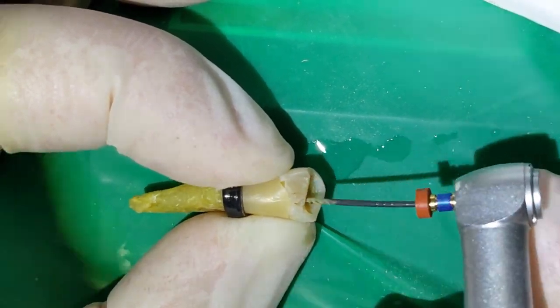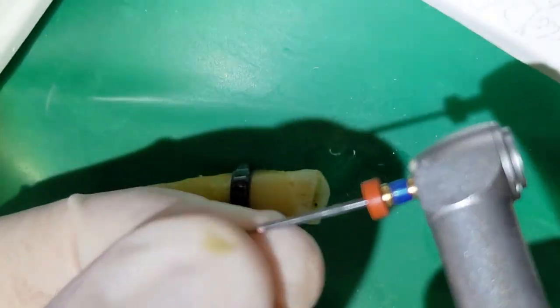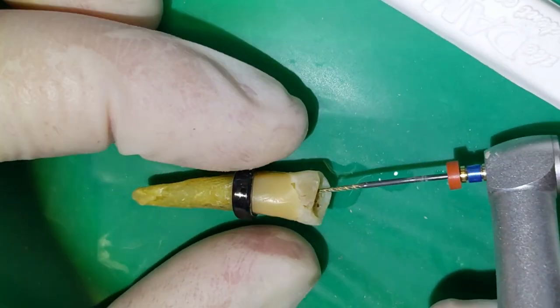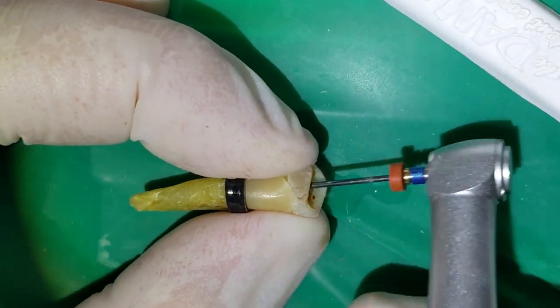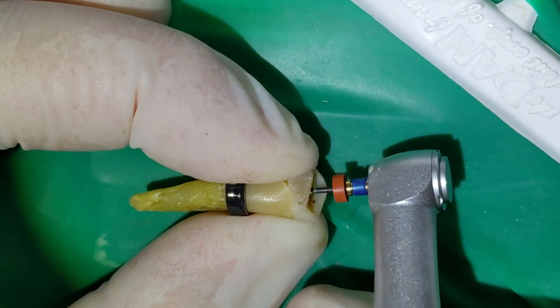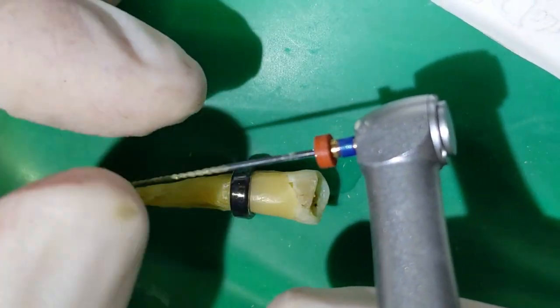Okay, 30 is going down to length. Excellent. And you can see all the debris that's coming out on the flutes. That's all material from inside the tooth. In this case, everything was dead before we started. But then there's also shavings from the inside of the root canal as we're cleaning that up.